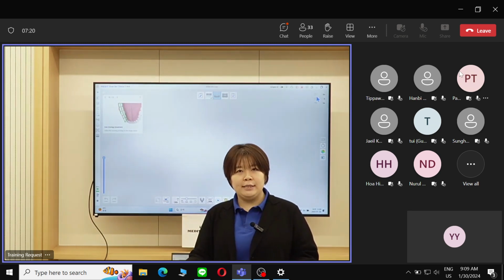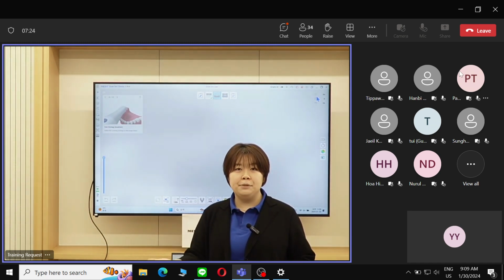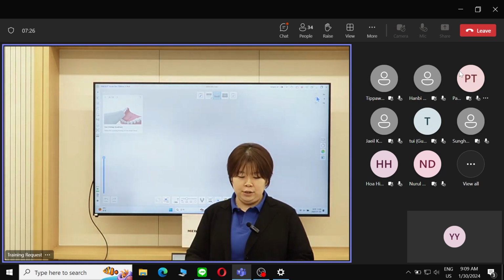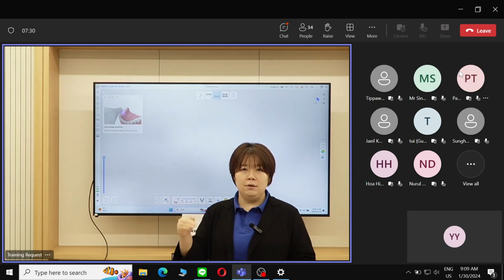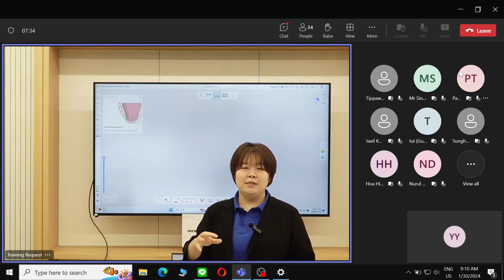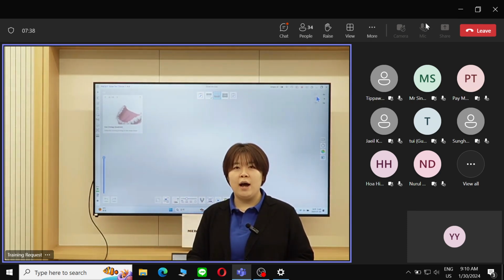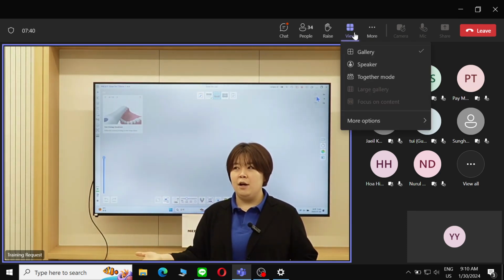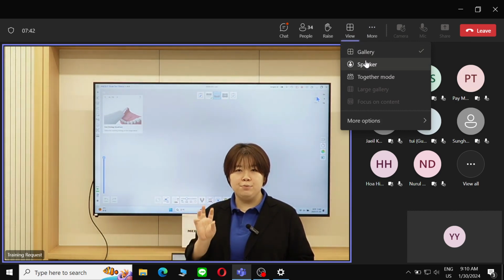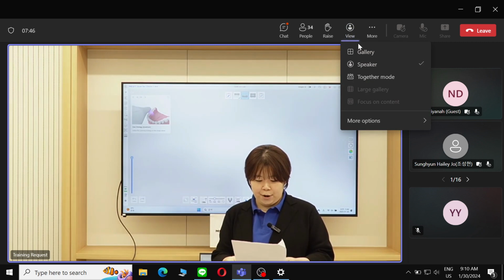So in the past year or so, maybe we've been focusing more on introducing the apps or some specific scanning functions and things like that. But in the new MEDIT Link version, we're sort of coming back to the basics. And so we would like to show you how our research and development team has been working on improving the technology so that the experience can become better.